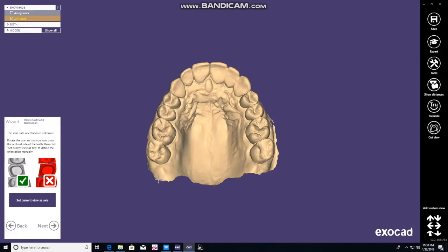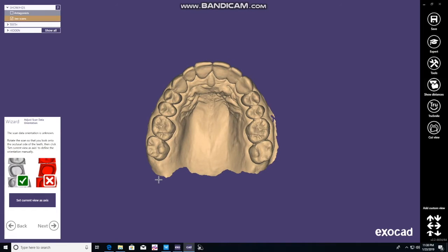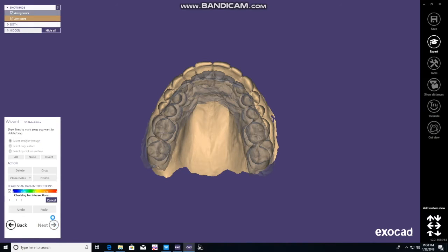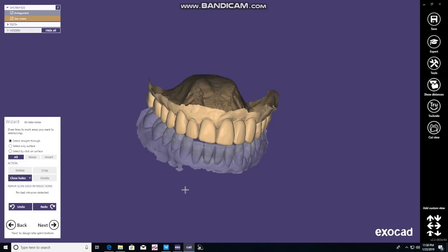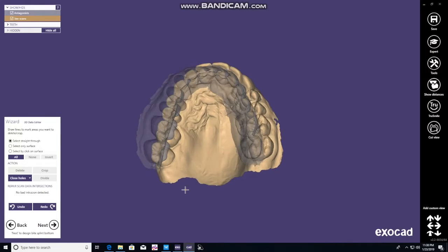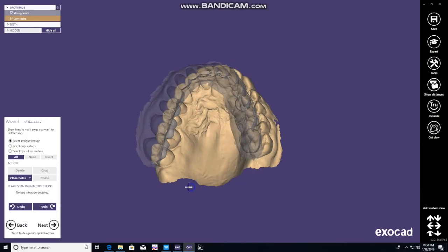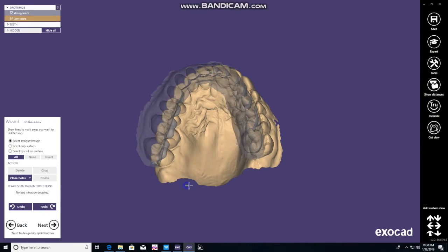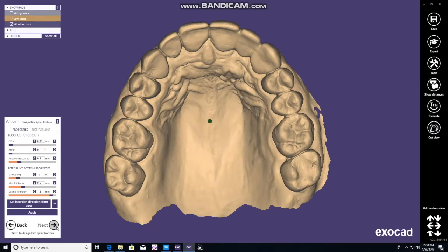This is the insertion angle, so you'll notice that we want to get it in a certain orientation so that we can insert the appliance. Here you can trim any excess. If you click and drag, you could highlight different areas and delete them, or highlight and fill holes. In this case we're fine — go to next.